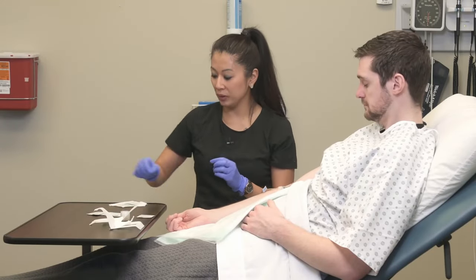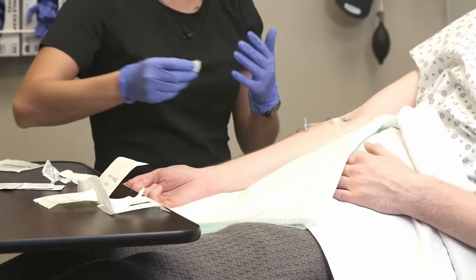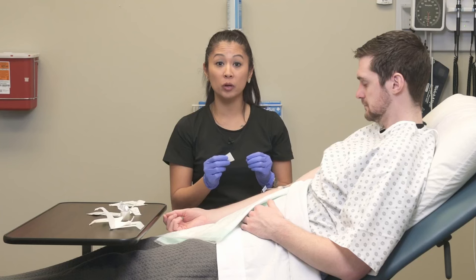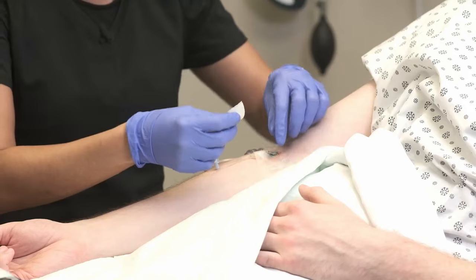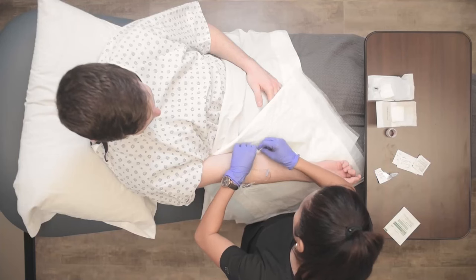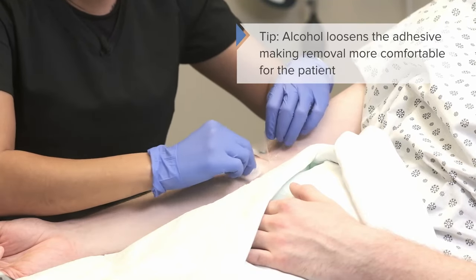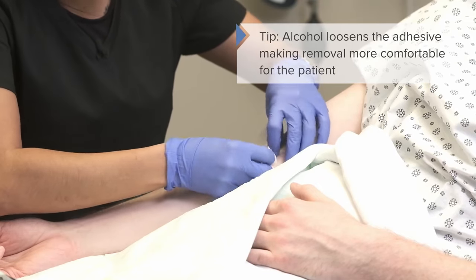Now I'm going to take an alcohol pad. Everybody's a little different, but I like to use an alcohol pad just to loosen up the sides and the tape. Your facility may also have an adhesive remover that looks a lot like these alcohol pads, and you can use that too. We're going to pick a side and slowly start peeling back the corners. The alcohol loosens the adhesive and makes it a little less painful for the patient.